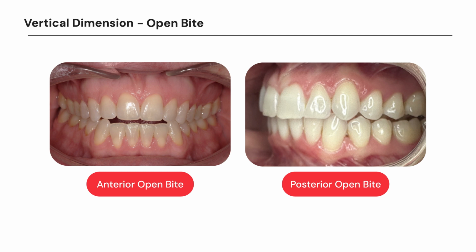We look at the picture on the right now, and what we see is the teeth don't touch in the back. That almost always is associated again with some sort of dental abnormality of one sort, actuated and caused by a dental treatment of some sort as well. We'll cover that in detail. Oftentimes people say, oh, it's due to the thickness of the plastic when you wear clear aligners. Almost never is it associated with that. That was something that we used to think a long time ago.